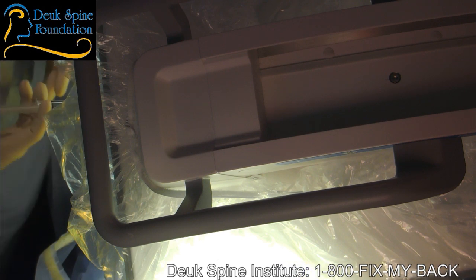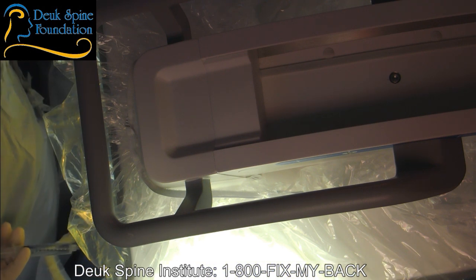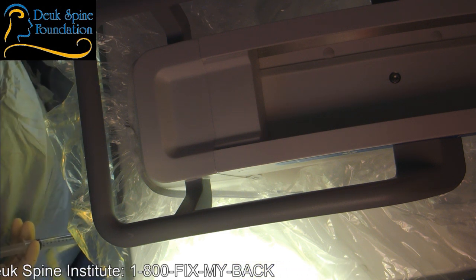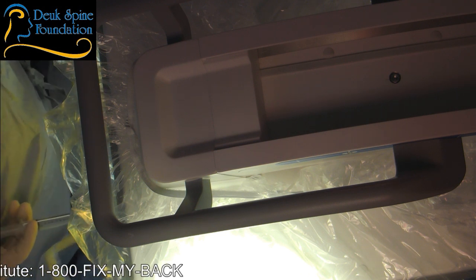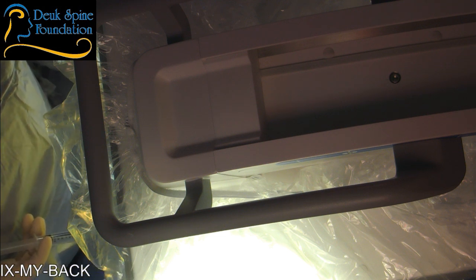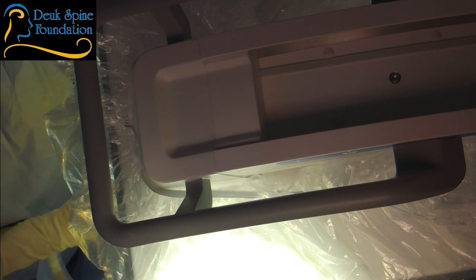Any radiculopathy down your legs or radicular symptoms, you'll let us know. Perfect. Thank you. This is my hand on your back, okay? So I'm going to go ahead and get started. I'm going to give you a little bit of numbing medicine. You'll feel a little stick and burn, okay? All right.